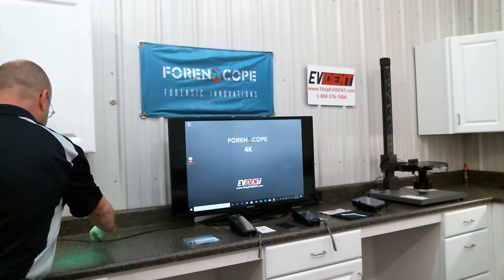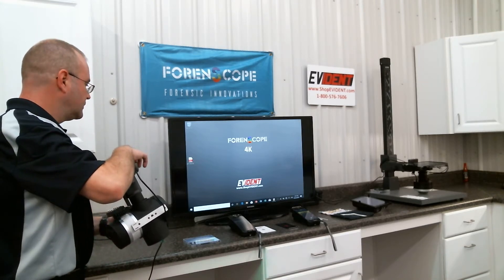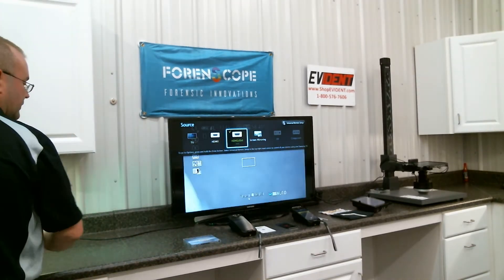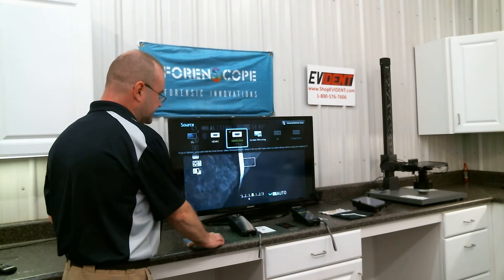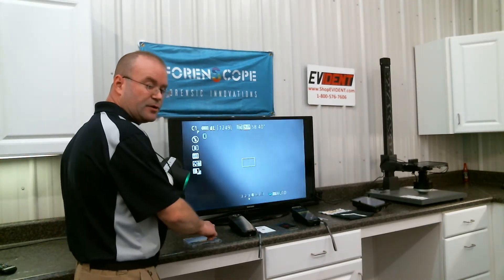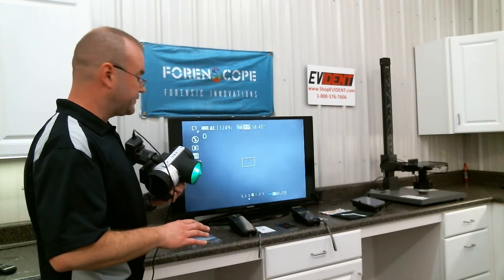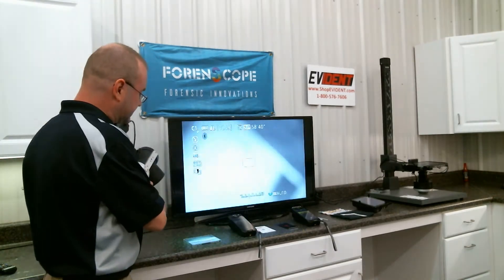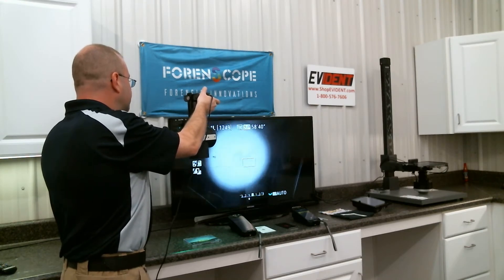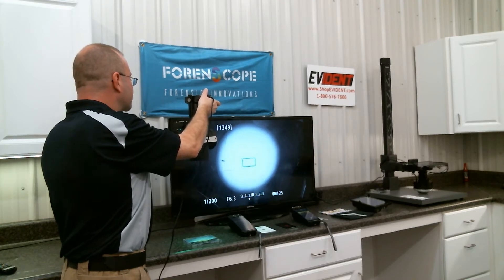I'm going to plug the camera into this display so you can see the results. So I have a plastic CD case here. It's a reflective plastic and there's a latent fingerprint on it. I can barely see the latent print — I can see the oil sitting on the surface. So I position the system over the CD and I want to get the spotlight right in the middle of the viewfinder. And there's a fingerprint there.